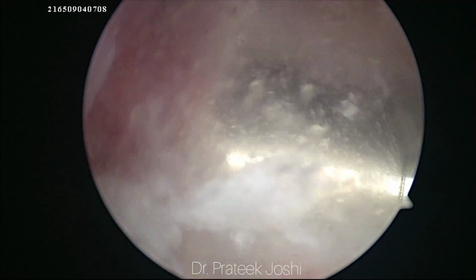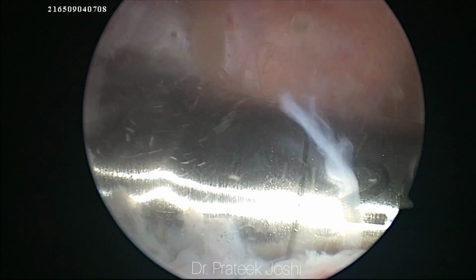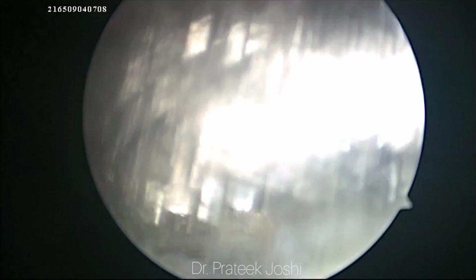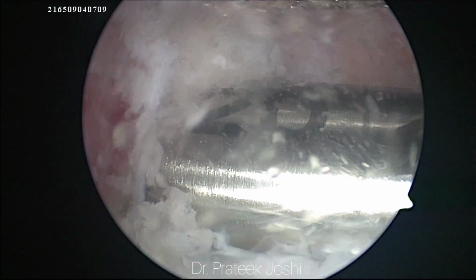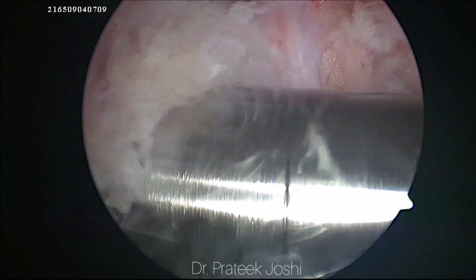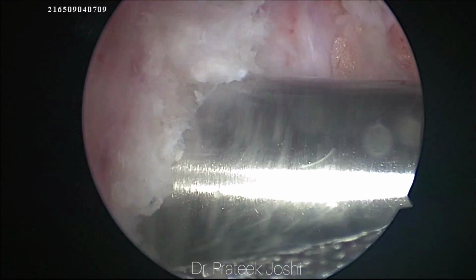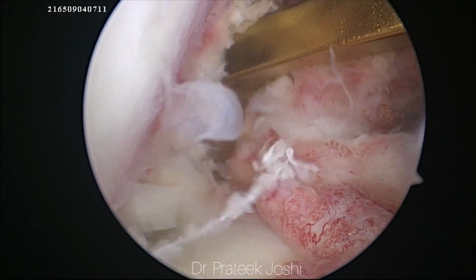So now again we are going to insert the guide wire in the same track, and now we are going to drill our femoral tunnel based on the diameter of our ACL graft, which we have already prepared. Here I am going to use a 20 mm continuous loop endobutton so that we have 18 mm of graft inside the femoral tunnel. So in this case I am going to drill 18 plus 10, that is 28 mm, so that we have adequate distance for our button to flip.